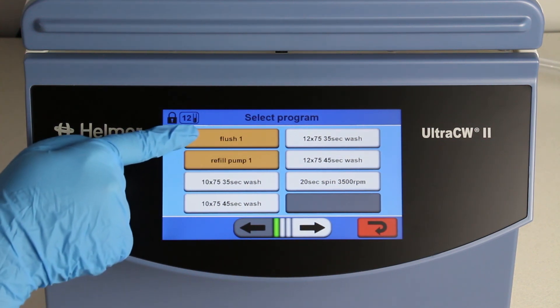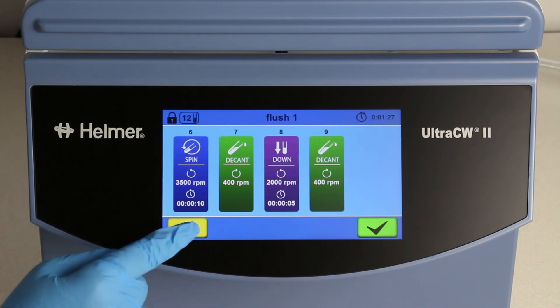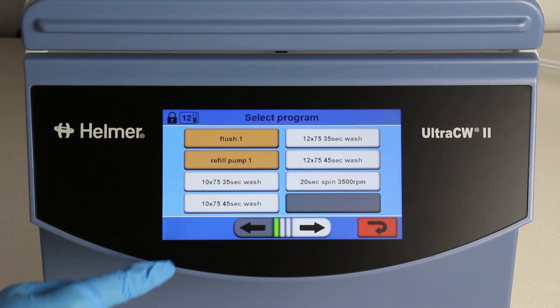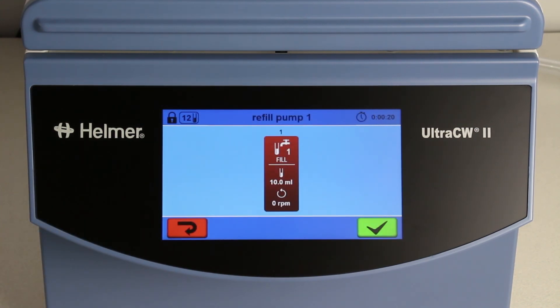The flush program is designed to automatically clean the chamber as well as the saline inlet and outlet, eliminating the need to do manual cleaning. The refill pump program is designed to refill the external and internal tubing system with solution and eliminate air bubbles in the line.